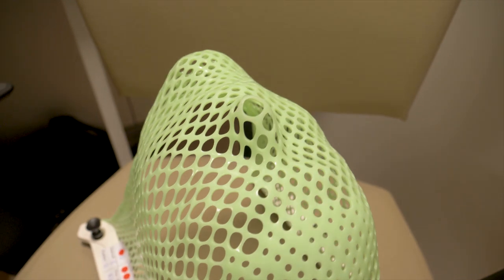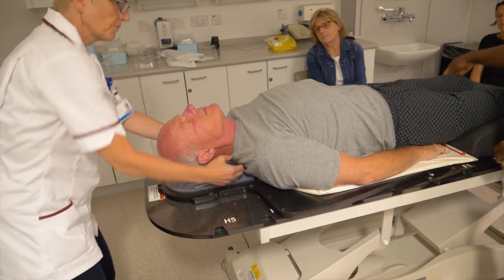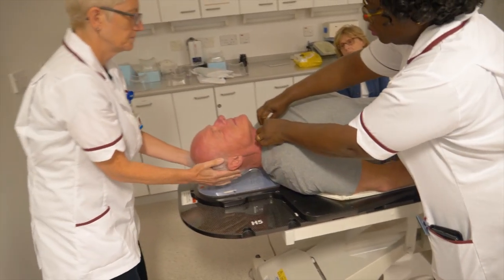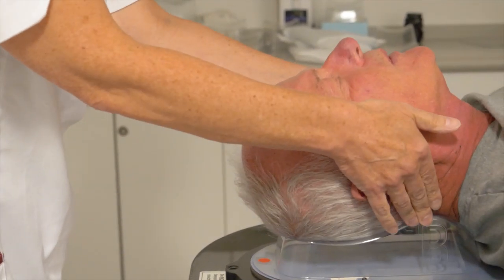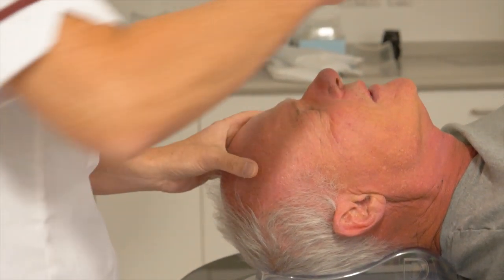Sometimes it's just called a shell. The whole point of the mask is to hold your head and neck in exactly the right position so that when high energy x-rays are fired towards the brain tumour, it's as accurate and as effective as possible.